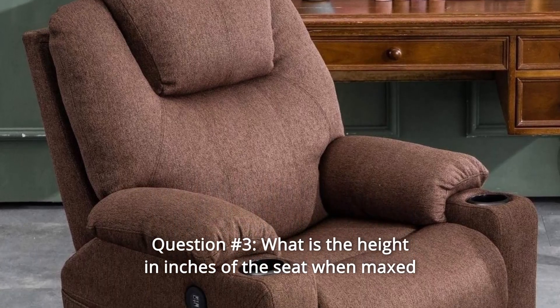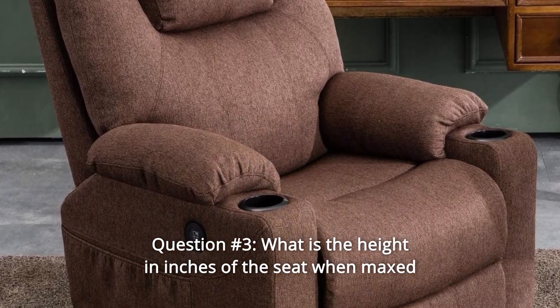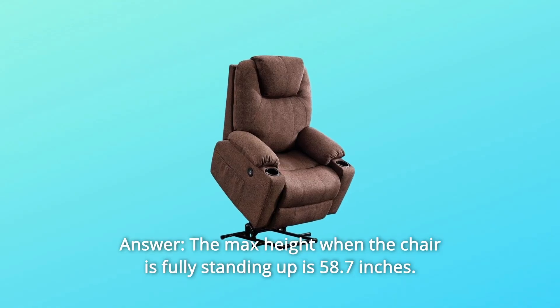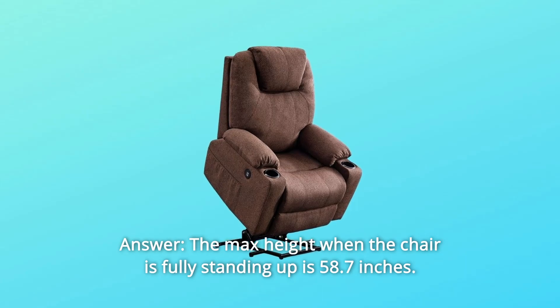Question 3: What is the height in inches of the seat when maxed out to help a person stand up? Answer: The maximum height when the chair is fully standing up is 58.7 inches.